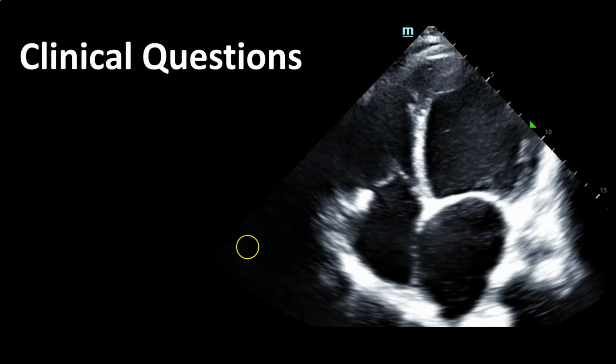Okay, so as a brief reminder, we talked about the clinical questions for an echo, right? Every single ultrasound we do has a series of yes-no binary questions that we're trying to answer, specifically when done in the point-of-care realm. There are more advanced topics that will do comprehensive echoes. Our goal is to never do one of those, right? Our goal is to simply answer the clinical questions at hand for the patient in front of us and to recognize the limitations of what you're doing compared to a cardiology or radiology performed study, whatever the case might be.